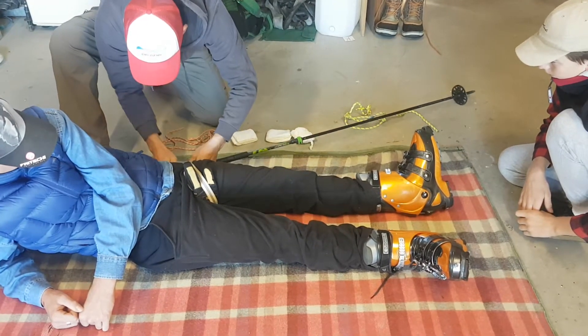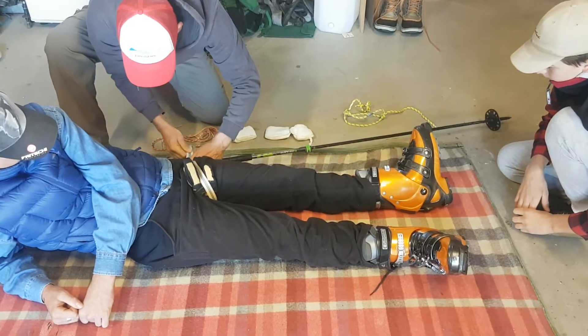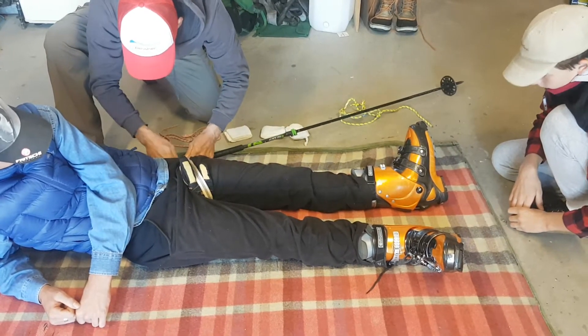Before and after splinting, you have to check for nerve sensation and movement in the toes, and a pulse before and after splinting.